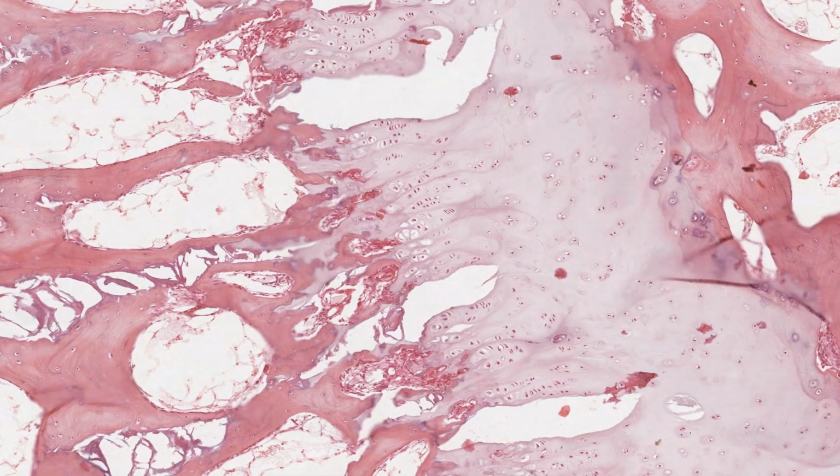Here is an image of the epiphyseal plate viewed at a higher magnification than in the previous image. Endochondral bone formation takes place from both of its faces. However, this finger is from a young adult and its growth has dwindled to a snail's pace. The individual developmental zones in the epiphyseal cartilage have regressed to a minimum. Growth on this epiphyseal side is even slower than on the diaphyseal side here, and the stages are more abbreviated.